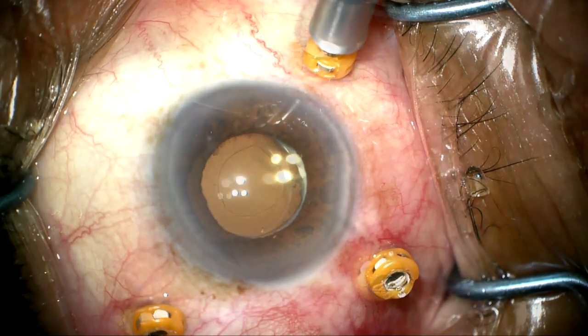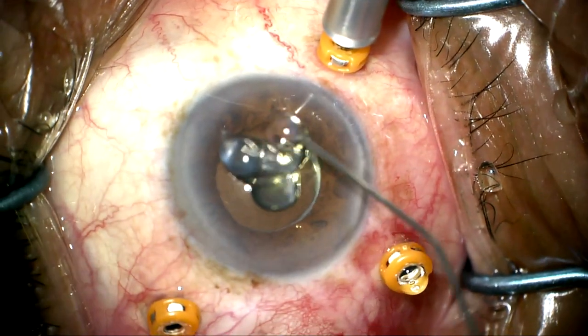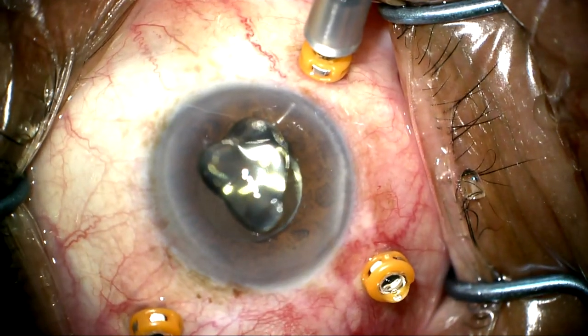At this point, I'm going to go more posteriorly and make sure we've removed all of the vitreous, as this patient was complaining that he had floaters prior to this problem developing. And you can see he has pretty turbid vitreous. I also want to make sure that none of this lens debris has fallen posterior with my manipulation and will cause a problem later on. So we're going to do a more complete posterior vitrectomy here.